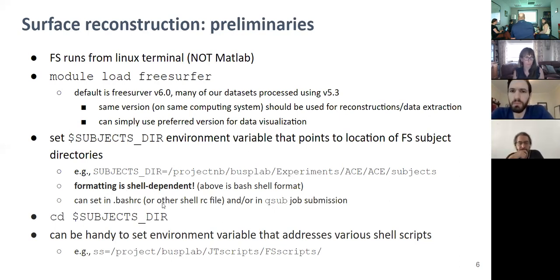Okay, well, the only actual useful information I have about bashrc versus others is how you define this variable. If you're not really comfortable with what environment variables are and how they work, you should spend a couple hours getting there, because using our Linux system is going to be so much easier, and a lot of processing will be easier.